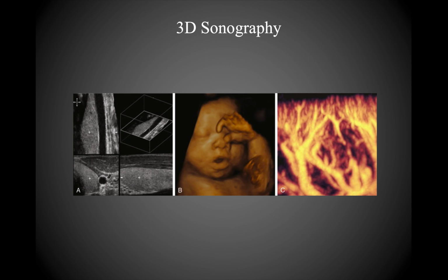So just real quick to summarize before we move into this 3D sonography. What I really want you to realize is that although it's difficult to interpret ultrasound images, there are some things that can help with it. So number one, ultrasound images present white echoes on a black background. So again, you should expect structures that the ultrasound waves come into contact with and send a signal back to the ultrasound probe, that is going to generate a white image.